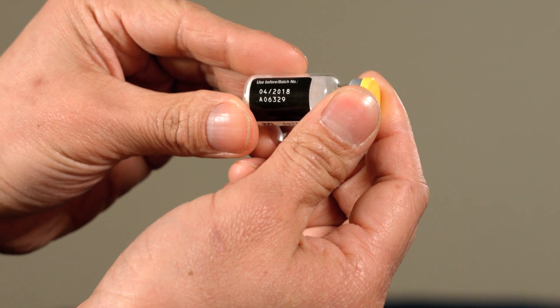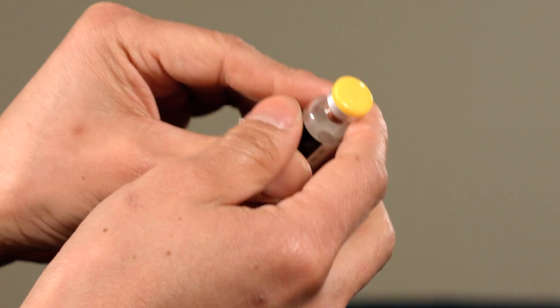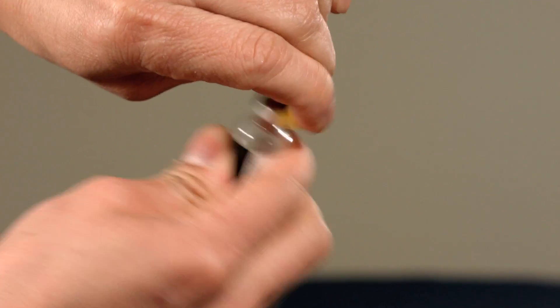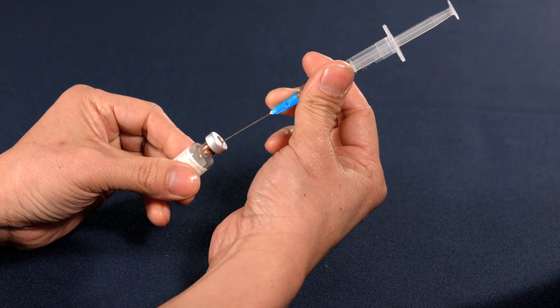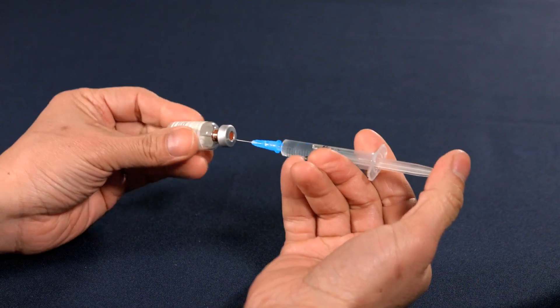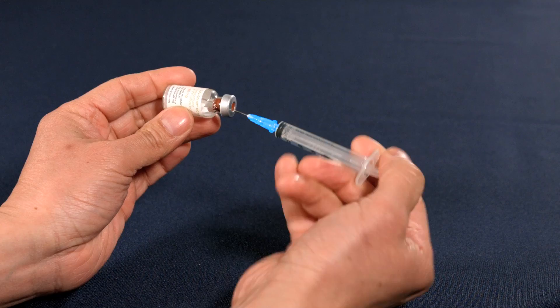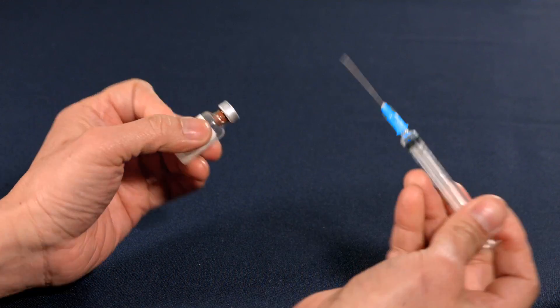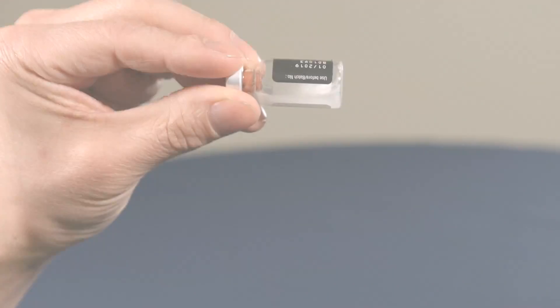Check the expiry or best before date on the bottle. If it's expired but it's the only medication you have, use it anyway. Now lift off the yellow plastic seal. Insert the needle into the rubber stopper at the top of the Solucortef bottle and slowly depress the plunger to release all of the water. Gently agitate the solution, allowing the powder to dissolve.